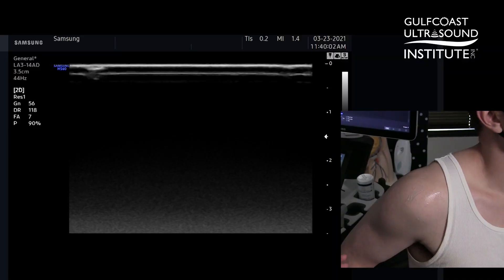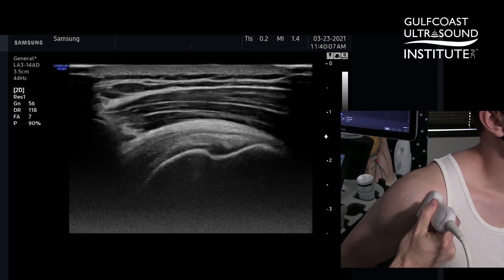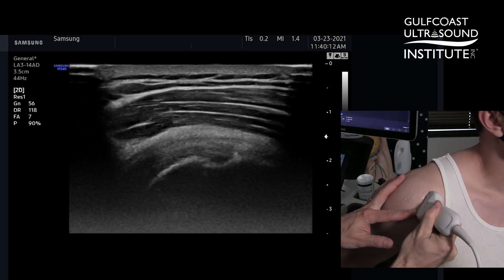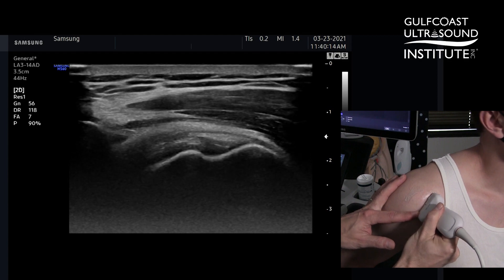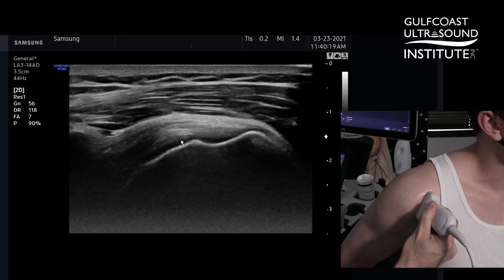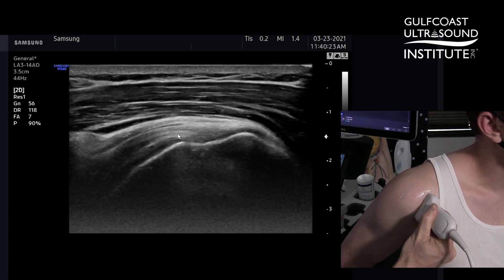I'll place the transducer on the front of the shoulder pointing at the patient's ear. This will give me a long axis view of the supraspinatus. I'll then move anterior and medial to find the biceps tendon, and when I see the biceps tendon right here, I will turn the transducer to make sure that I'm in the long axis plane.